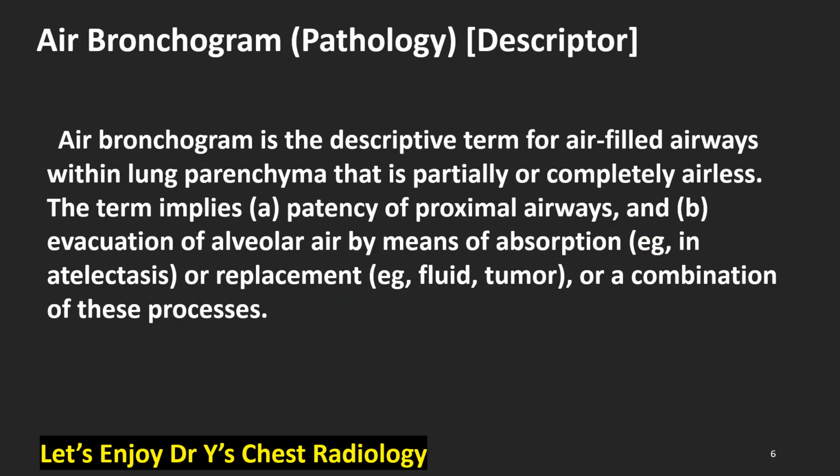Air bronchogram, pathology, and descriptor. Air bronchogram is the descriptive term for air-filled airways within lung parenchyma that is partially or completely airless. The term implies a patency of proximal airways and evacuation of alveolar air by means of absorption, e.g., in atelectasis, or replacement, for example, fluid or tumor, or a combination of these processes.